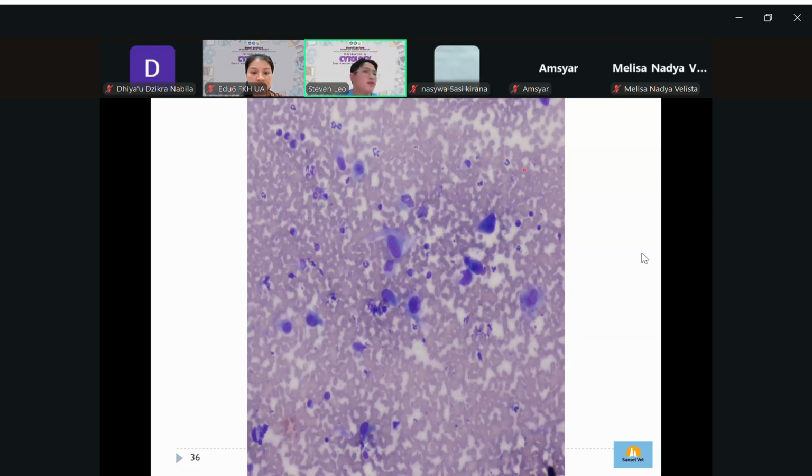Okay, let's say if you just blink your eyes, what is the most obvious thing that you're going to notice? Is it the inflammation, or is it the obvious cell, like I don't know what's going on with the cell? What do you think? I feel it's more the cell than inflammation. It's more like a weird cell, right? I don't know what's going on with this cell, but something's going on there. Okay, let's say if it's more cancer, then I need to think, is it typically epithelial?